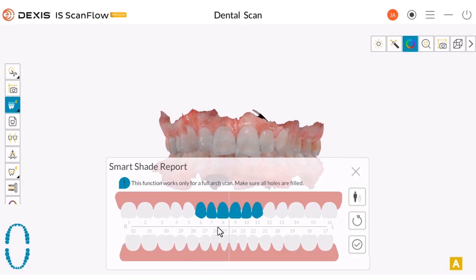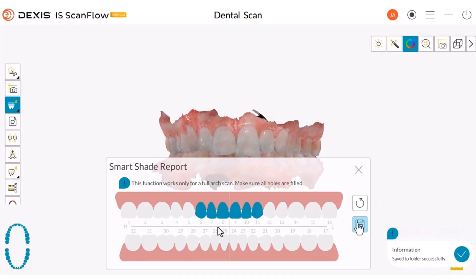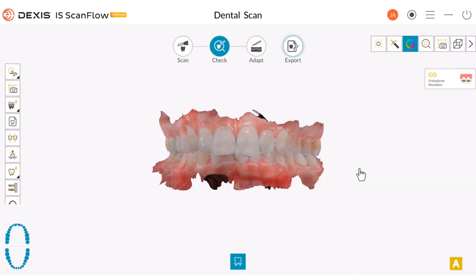Once the report is ready, you can choose to create your report. Click Save — the software will create a PDF version of the SmartShade report. The report is automatically saved to the patient's record. Once saved, it can be used in IS Connect and sent through the IS Connect portal. If you choose to email the report, you can manually pull the report and email it. Click the X to exit.